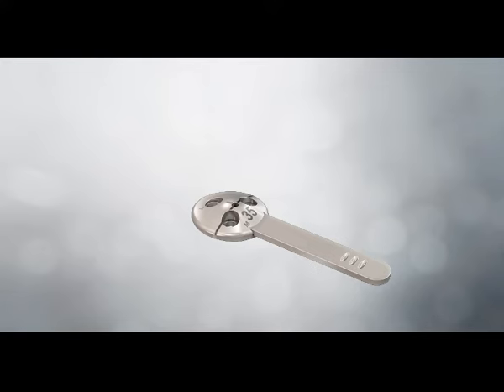The size of drill trial is selected for maximum patella bone coverage. Medial lateral location of the patella implant apex is verified relative to the native anatomy ridge. The trial handle may be used to aid in determining optimal position. When properly aligned, the handle should be perpendicular to the long axis of the leg and parallel to the prosthetic joint line. If the modular patella clamp is used, the drill trial is assembled onto the clamp. The trial is pressed onto the bone engaging the spikes. With the drill through trial secured in place, the holes are drilled using the lug drill. The sclerotic bone is prepared to ensure a continuous cement mantle with good cement interdigitation of 2–4mm.